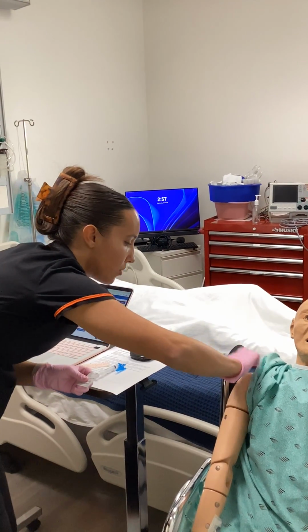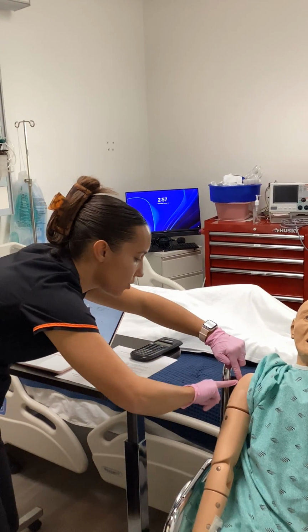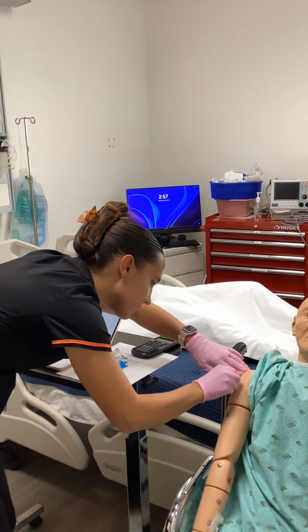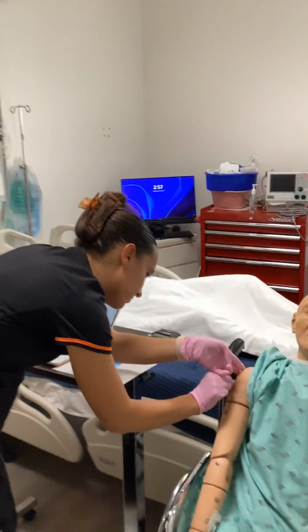So you check from the bone right here, 2 fingers down, and then we are here on the deltoid at this triangle. So that's where we're going to be giving it. So I'm going to wipe this spot right here. So we have our 2 fingers right here.